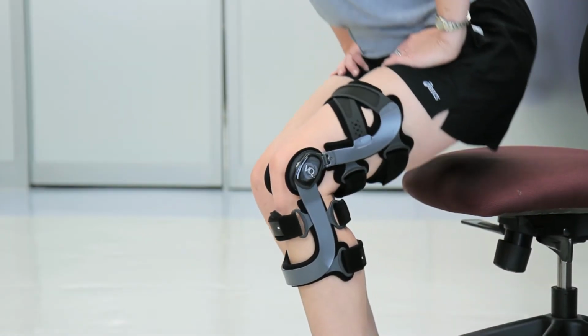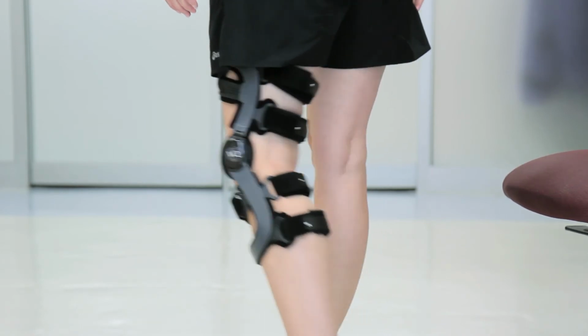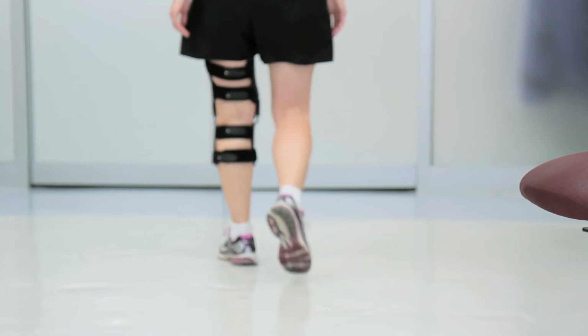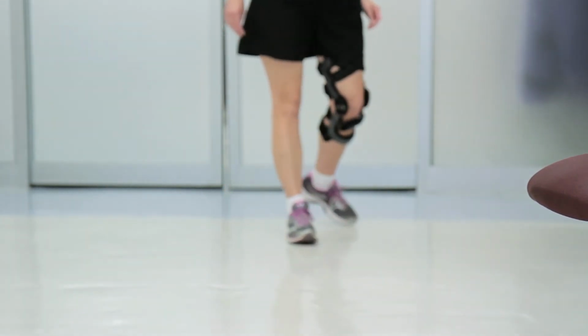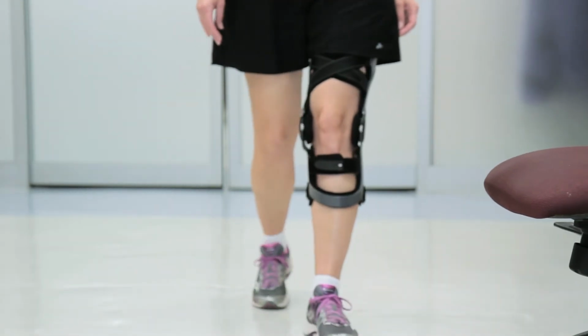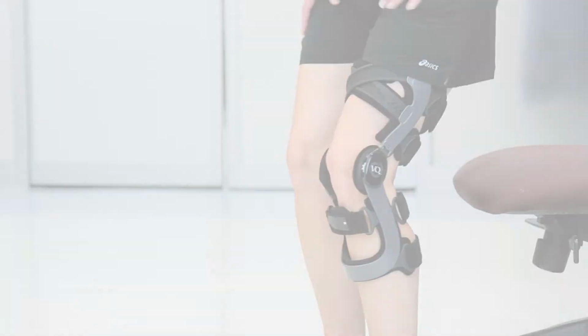Have the patient walk around a little. They should only feel a gentle pressure on the knee at the medial condyle pad. If the pressure is uncomfortable, adjust the medial Q-hinge back 1/8 turn. If the patient feels no pressure at all, try an additional 1/8 turn counterclockwise. Do not overcorrect, as this may cause soreness or pain. Sit back down and readjust if necessary.